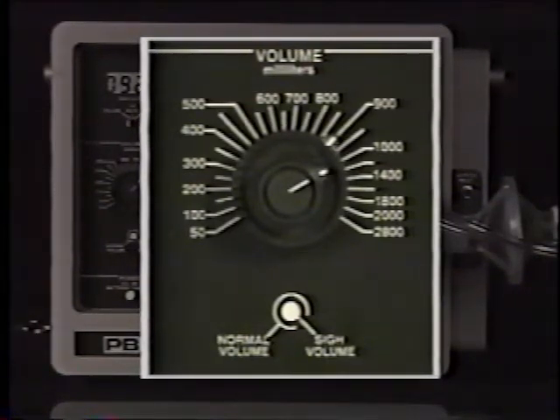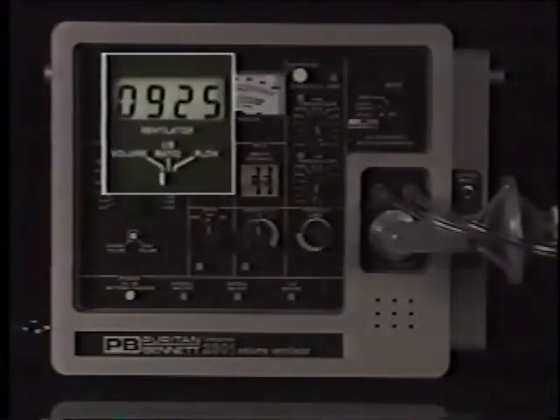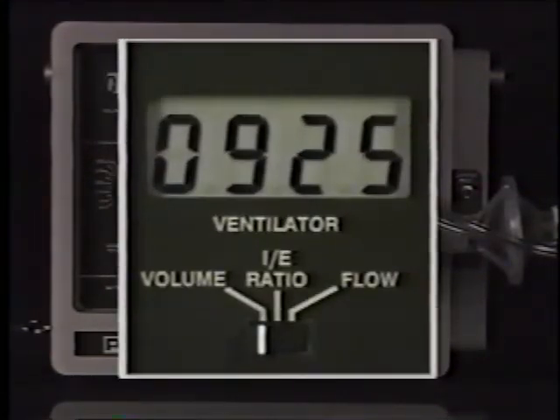There are two volume knobs. The larger knob, labeled Normal, controls the volume of air to be delivered at each normal ventilator breath. The selected volume can be checked at the ventilator display when switched to the volume position. This information is updated at the end of each ventilator breath.